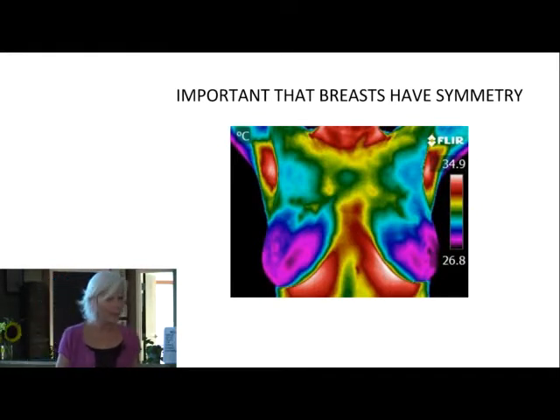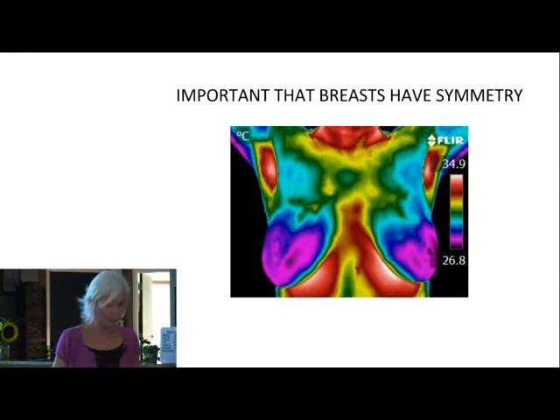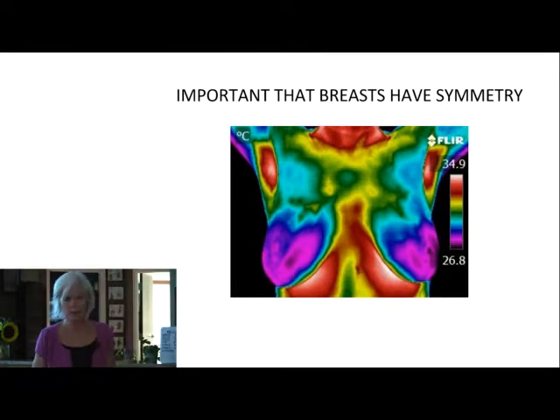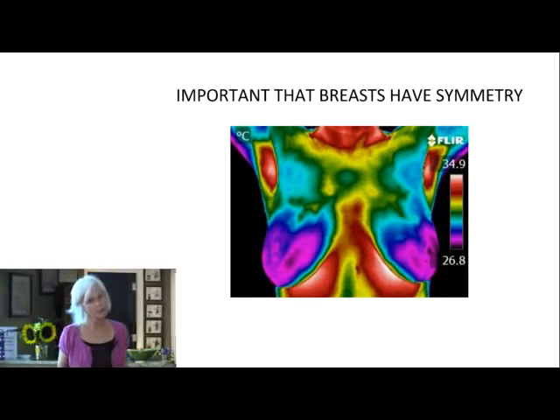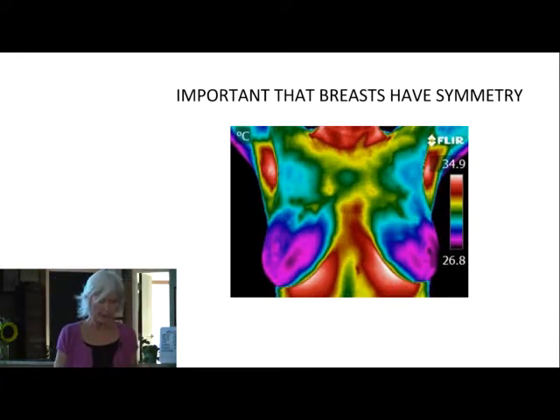It was approved by the FDA in 1982. When I say approved, it really wasn't approved. It was registered as an adjunct to mammography. It never caught on. It never became something that the physicians were trained to do. So, two reasons probably. The equipment, the computers in 1982 were antiquated. Remember? They were slow. The cameras were the same way. And of course, when you only need a thermographer, a camera, and an interpreter, there's not a lot of money in it. Okay? So it's a simple industry that doesn't employ a lot of people.